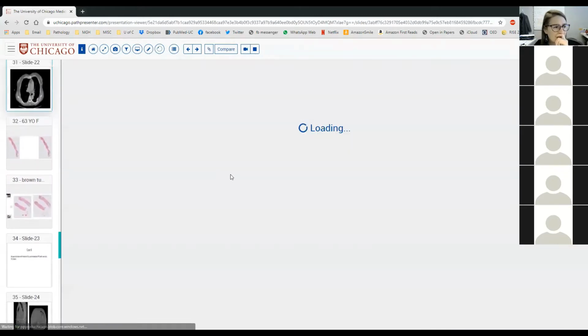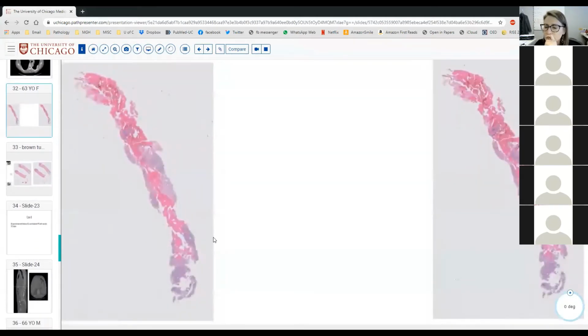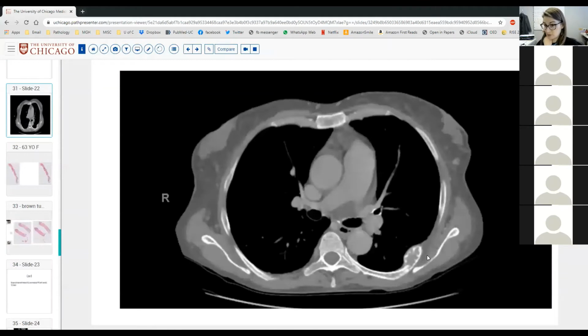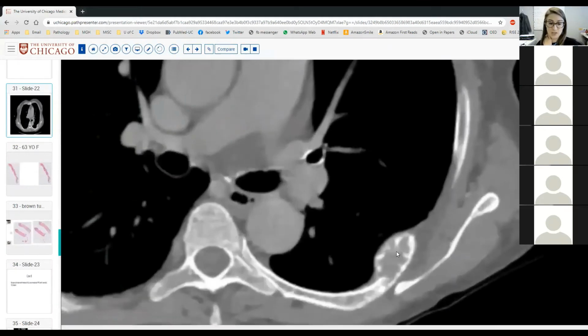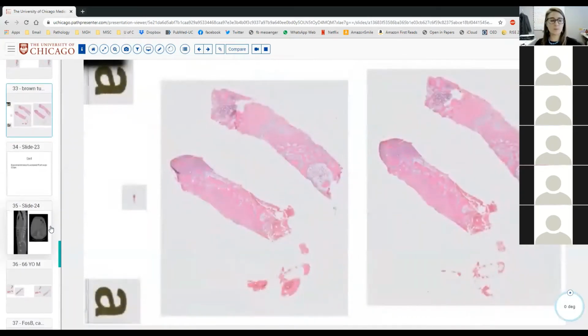So could we see giant cells, a lot of giant cells in fibrous dysplasia? Only if it has secondary aneurysmal bone cyst-like changes. Okay. So ribs are a great place anatomically for fibrous dysplasia, with this bowing out of the rib with a kind of ground glassy appearance. So the location will be great for fibrous dysplasia.